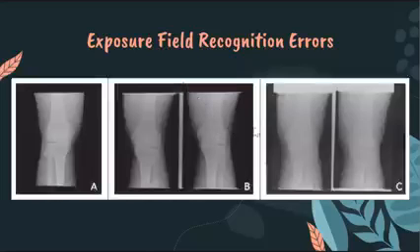That is why the result is this in letter C. The computer's calculations were thrown off because, as you can see, there is a light strip here and the overall quality of both images is underexposed. The figure illustrates the field recognition errors that resulted when the computer reads both fields and the space between them as one exposure. So the computer reads this as one exposure, one projection, all in all. 110 kVp was used to generate even more scatter.